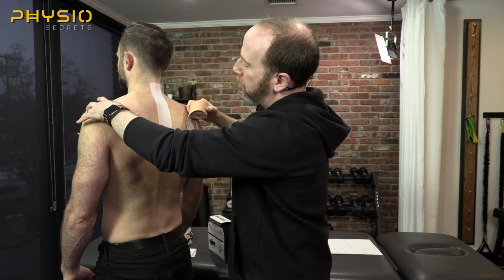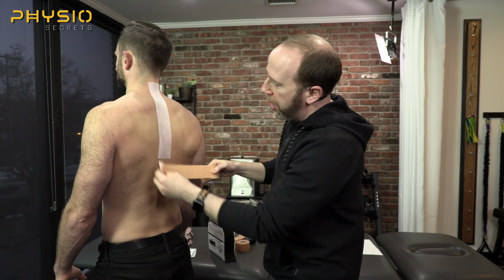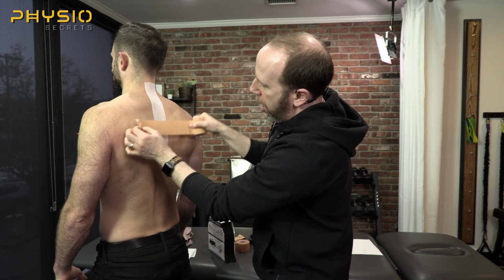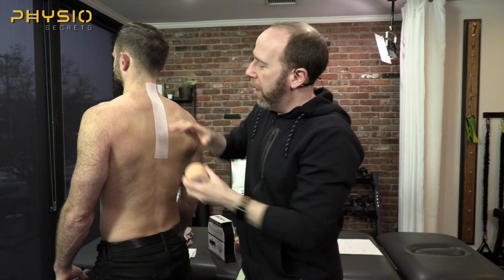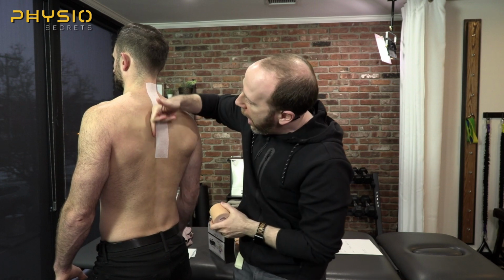So what I would do is I would have him retract a little bit, and I would set a strip here, here, and here. You put 3 of these things together in the same region, they're going to constantly pull back and offload the tissue that's here. How much? Probably just a little bit. But you want to know what? When this stuff goes on, people usually say, that feels so much better.